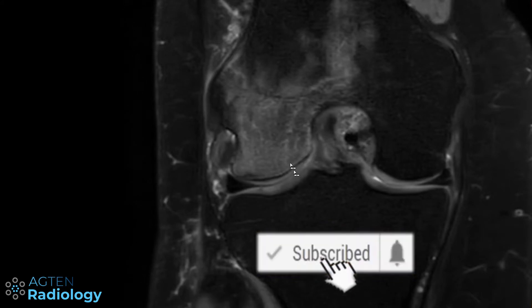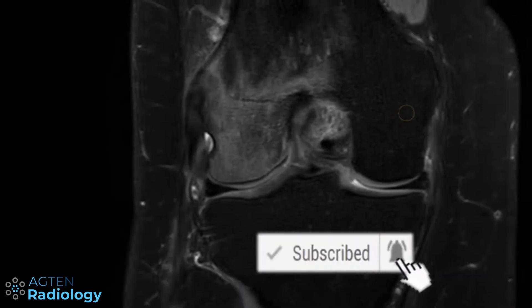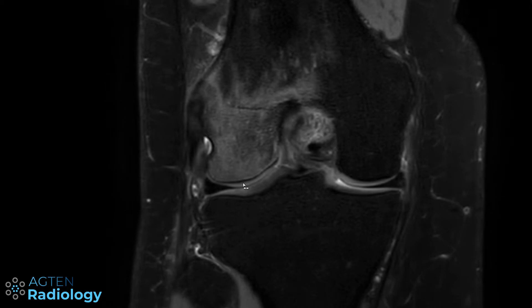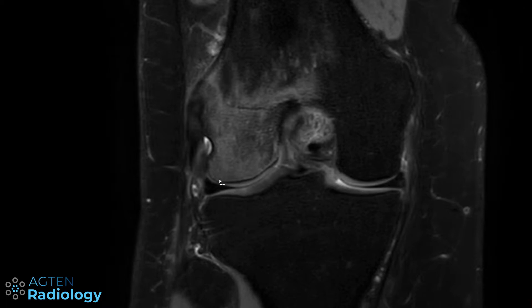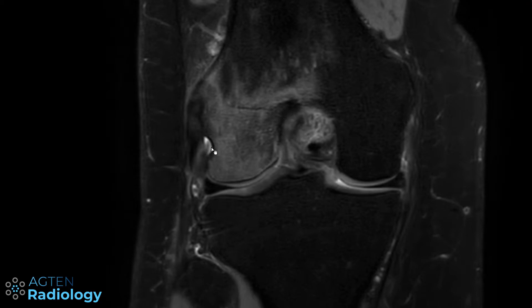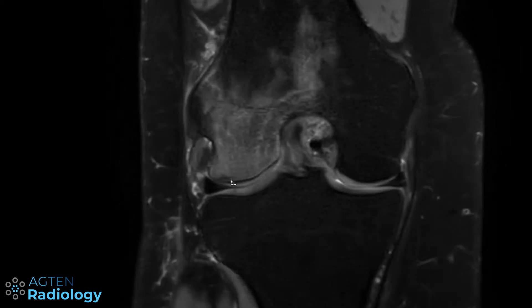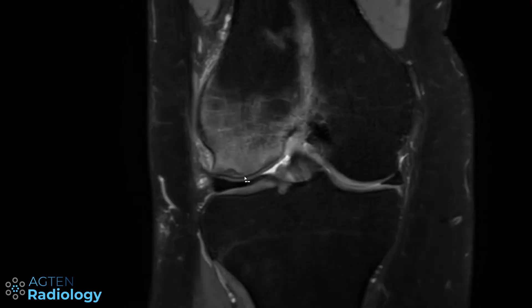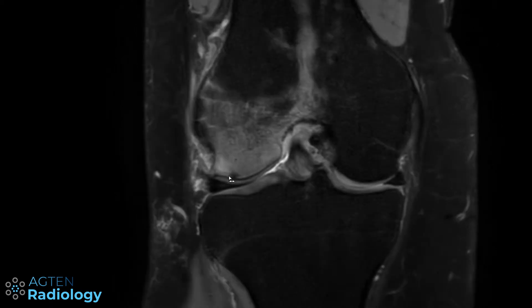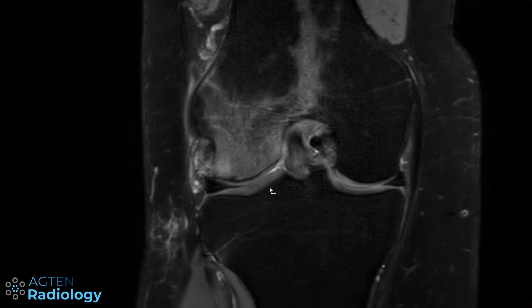Spontaneous osteonecrosis of the knee is frequently used for findings like in this case. Here we have severe bone marrow edema in the lateral femoral condyle, although more often the medial side is affected. Here we have a 40-year-old patient with the lateral femoral condyle affected. They have a sudden onset of pain without trauma, and on MRI you see this large area of bone marrow edema. Sometimes you see these hypo-intense lines in fluid-sensitive sequences, consistent with subchondral insufficiency fractures — and that's basically already the problem here.